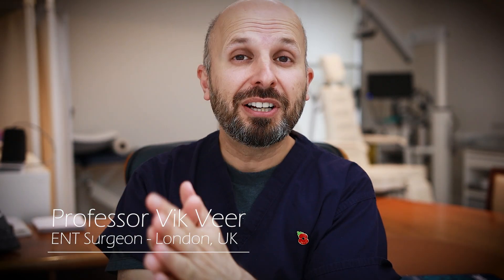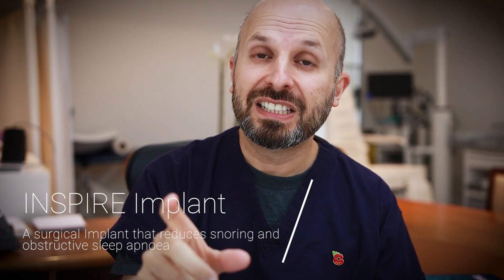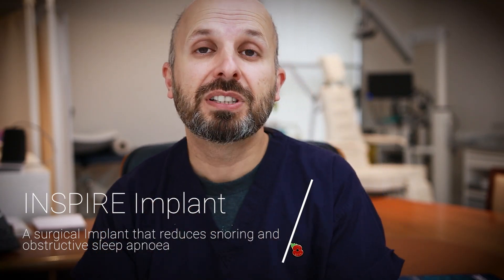Hi there, I'm Dick, the ENT surgeon. I want to do a very quick video about the Inspire implant. I've had a patient recently who had an Inspire implant put in because of his obstructive sleep apnea, and what I want to do is show you what it looks like inside his throat when the machine is turned on.